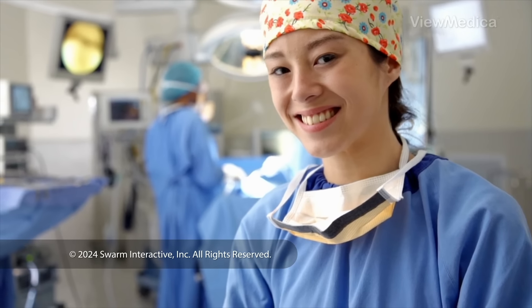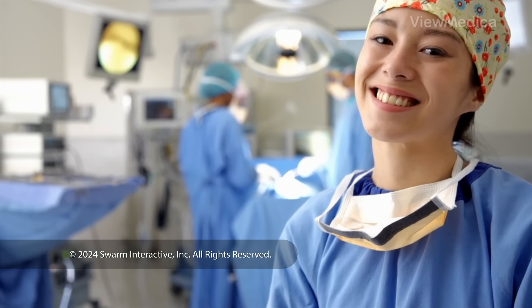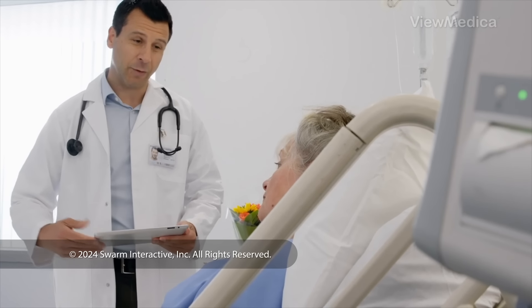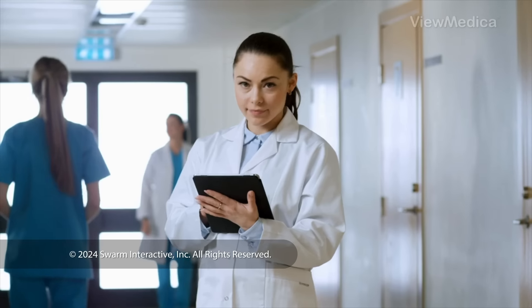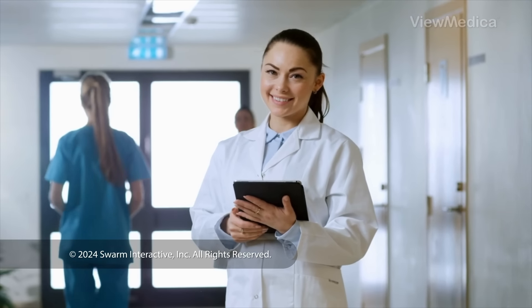After the surgery is done, we close the cuts in your skin and watch you as you wake up. Then you can go home. Follow your care plan for a safe recovery.